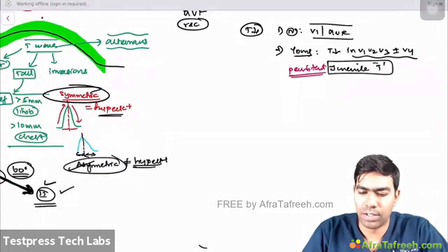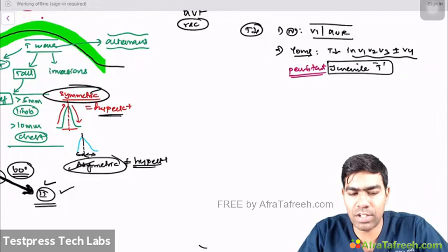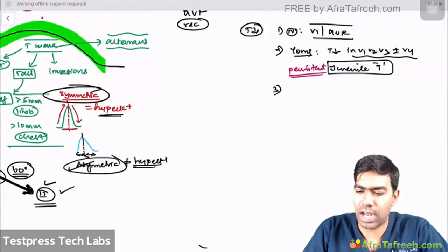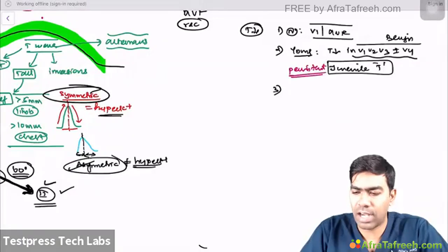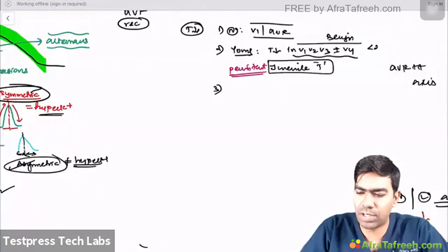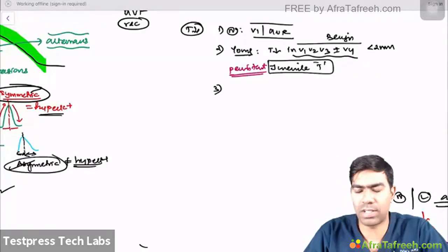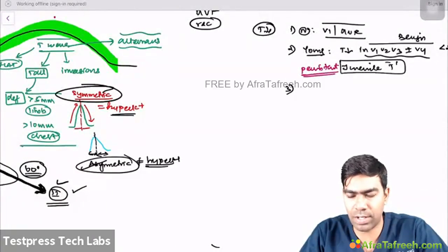That's all. So there are two benign conditions. One is juvenile T wave pattern, and second is persistent juvenile T wave pattern. Both can produce significant T wave inversions, especially in V1, V2, V3, and V4. And remember, they are very benign, and usually the amount of inversion that they produce is less than 2 millimeter. Very small inversions, not very big inversions, seen in the V1, V2, V3, V4 leads. Typically in V2, V3, mid-precordial leads is where you see.